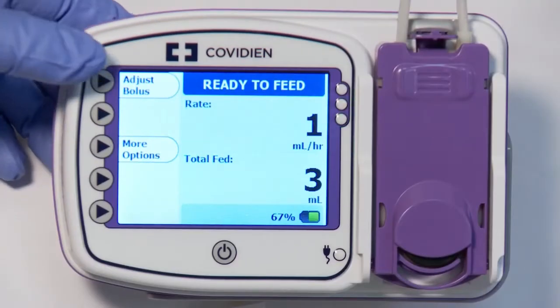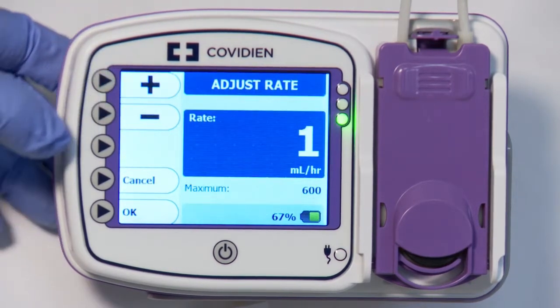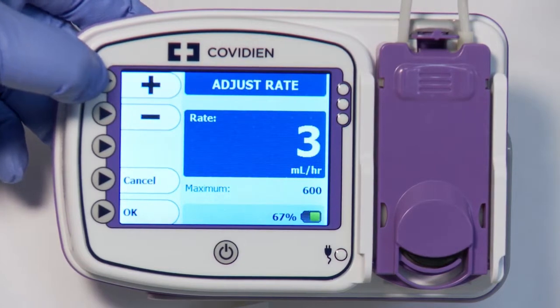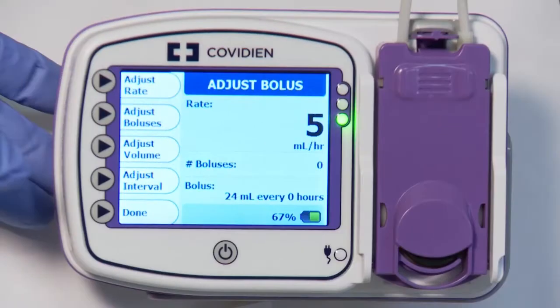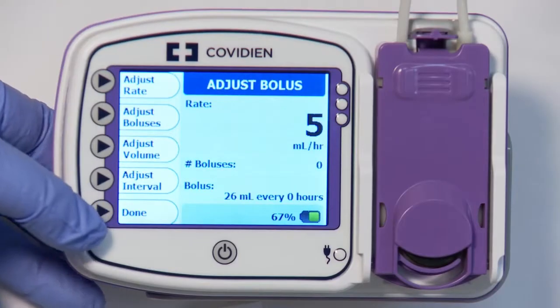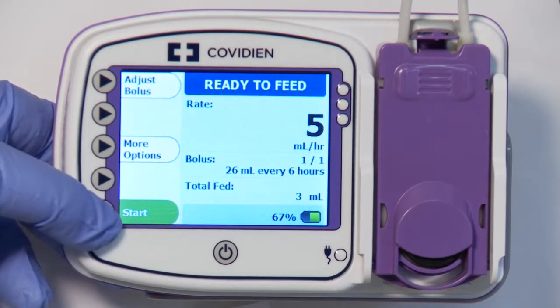Adjusting Bolus. The bolus option allows you to enter a fixed amount of feeding solution to be delivered to the patient, repeating at a fixed interval. Select Adjust Bolus. Press each of the option buttons to input the rate, boluses, volume, and interval. After each item has received input, press Done to activate. Press Start to begin feeding.